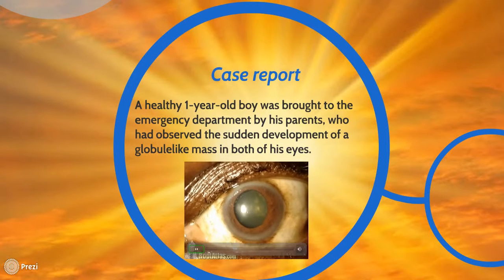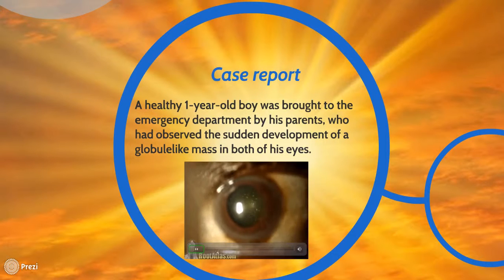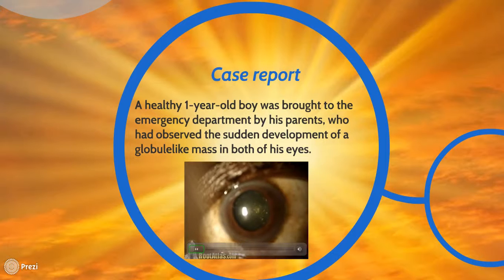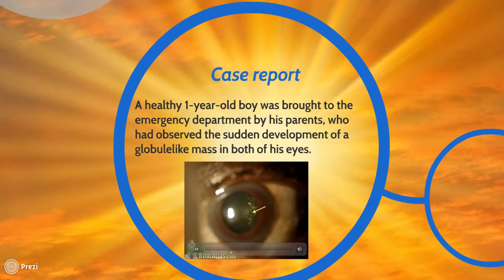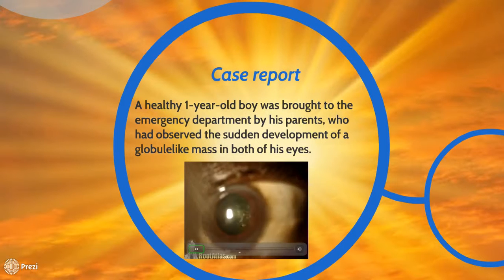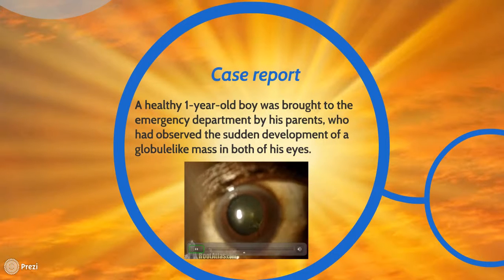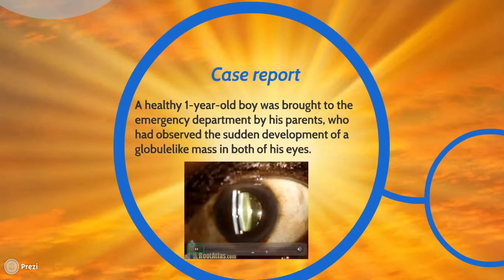Here's an interesting finding that I thought might be useful, perhaps for showing a patient. This is an eye with asteroid hyalosis. You can see these little white calcium deposits inside the eye. It's behind the lens in the vitreous cavity, and they float around just like floaters do. And as noticed by the patient, using a slit lamp beam, they really light up.